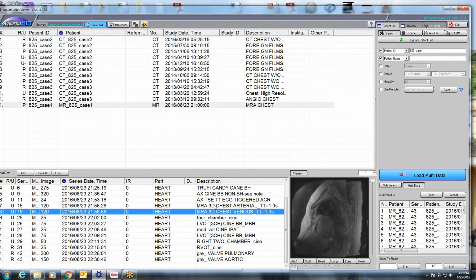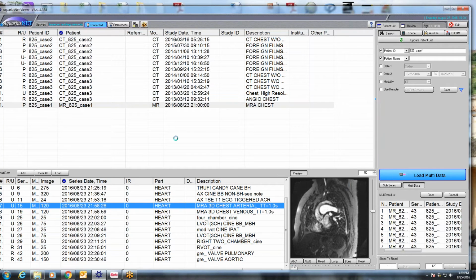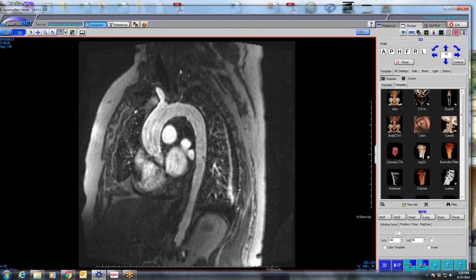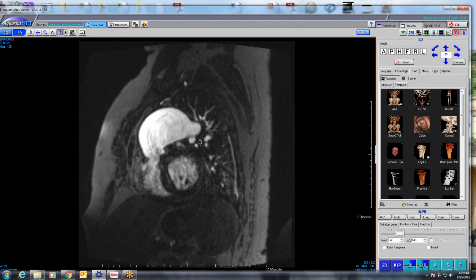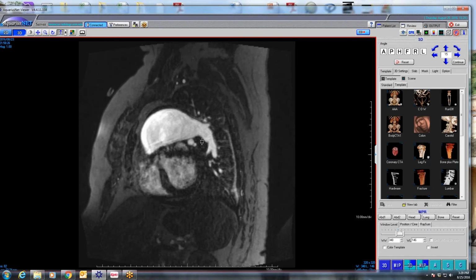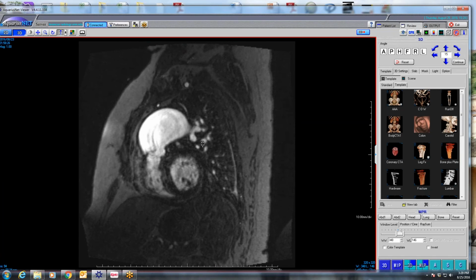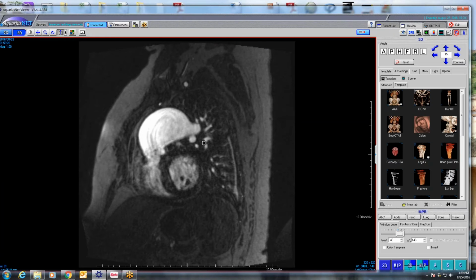Yeah, it's just interesting. I haven't seen it. It almost looks Marfanoid. It looks like an annular aortic ectasia, but it's on the PA. But she doesn't have any history of that, and I looked it up and never saw anything in relation with Marfan's with pulmonary valve issues. But interesting case.